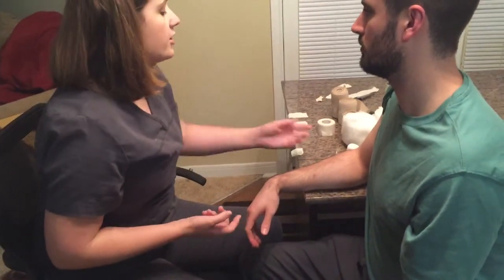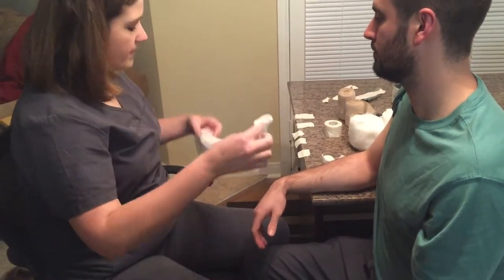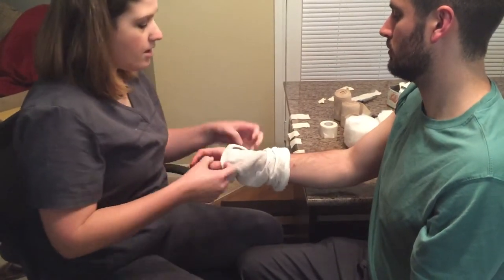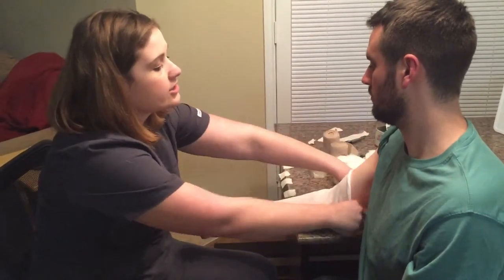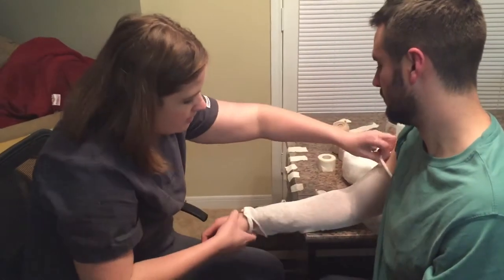I think we want to go ahead and get started. Today, what we're going to do is have an order for everything. First thing I want to do is put this stockinette on you. All this does is just protect your skin — that's all it's really for. As we do the wrappings today, it just acts as a barrier between your skin and all the wrappings. When you learn how to do this yourself, you want to always make sure this pulls up all the way up to two fingers away from your underarm.